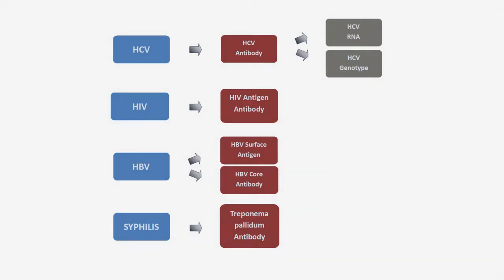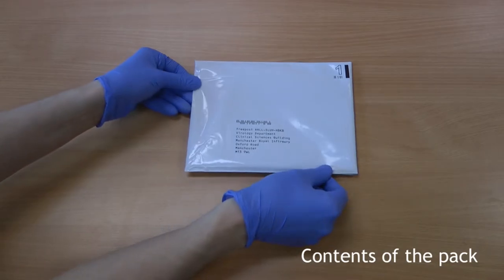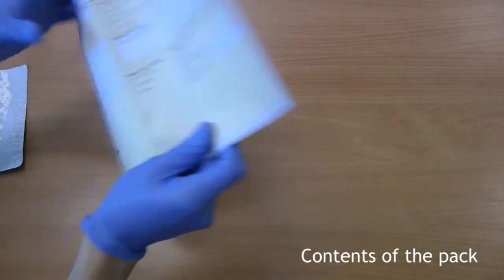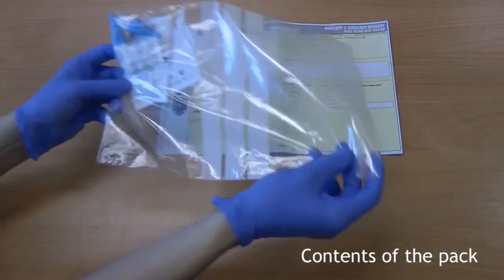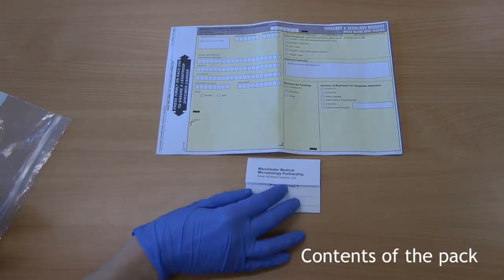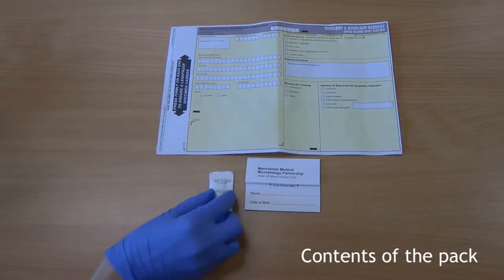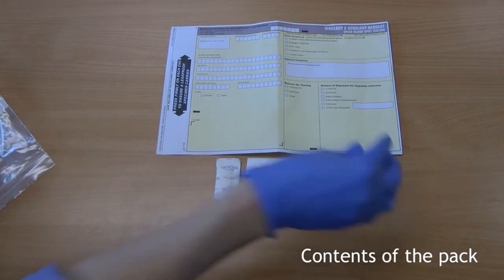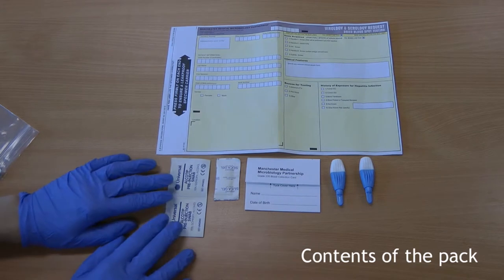Let's start with the kit. In the plastic envelope, you will find a request card and a plastic bag containing the dried blood spot card, a desiccant pack, two blue lancets, two alcohol wipes, and two plasters.